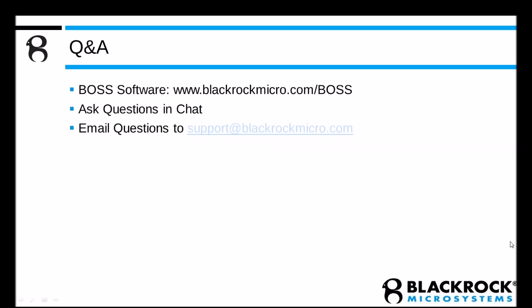The other question is, will it be able to work with EDF files? EDF is the European data file format. That's not one that's currently on our list to be developed right away. But you could always look for a file converter to put it into a different file format and load that into BOS as an option.